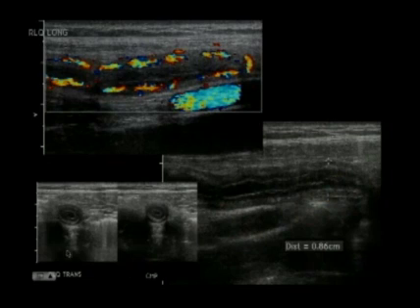More cases, again, transverse image, not compressible. They will not like it when you do this compression. It certainly hurts, but it's a nice confirmatory finding that you do in fact have appendicitis. In this case, there is some hyperemia. The appendix is swollen to almost 9 millimeters. No abscess, just a simple acute appendicitis.